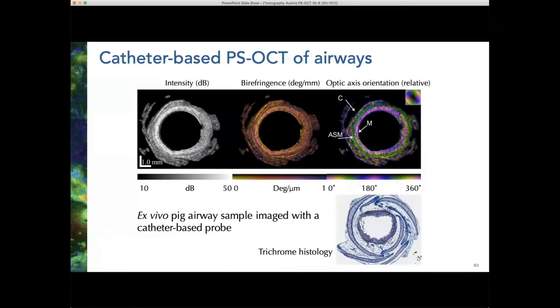We've done this in a number of samples and started to look at human cadaver samples as well. There's a lot of work ongoing in Western Australia on this topic. This shows the airway smooth muscle highlighted in green, very nicely visible in this particular sample.